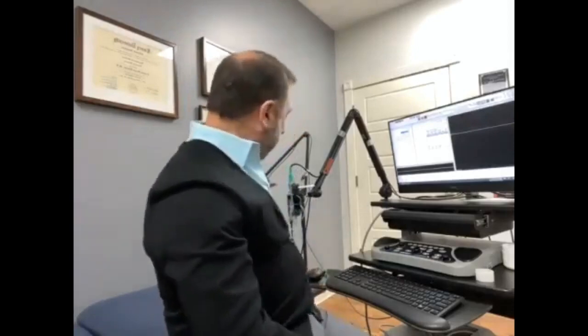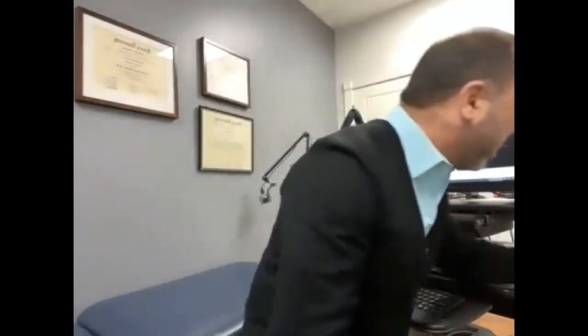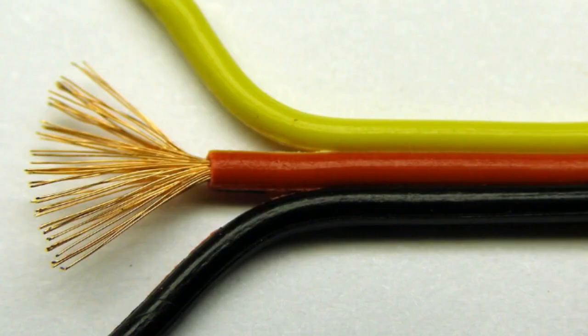Okay, so how does this work? Well, first of all, I'm going to take a wire. If you're watching this on video, you're going to see a green wire. This is actually a ground wire used in nerve conduction testing, but I'm using it to make a point. If I were to take a pair of wire cutters and cut this, and you can think of an electrical cord at home, it'd be the same thing. What would you see inside? You would see at the center the metal, that is the wire itself, and then around the wire is rubber. Now here, this rubber or plastic is an insulator.